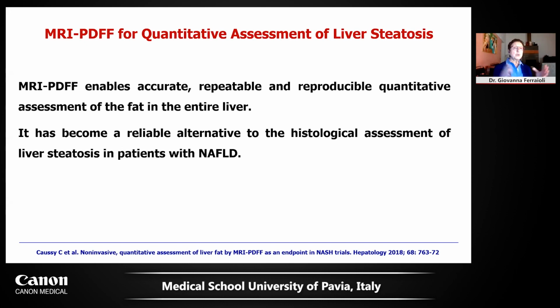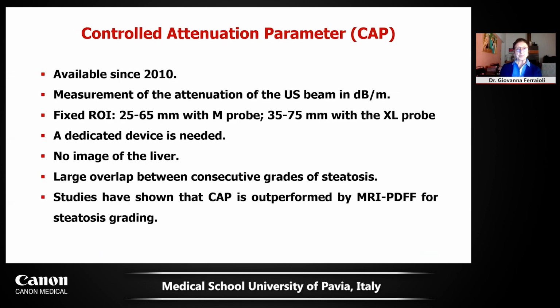On the other hand, we have to take into account that liver biopsy gives an assessment of fat in the liver in a categorical scale, whereas PDFF and tools available on an ultrasound system quantifying the attenuation give a numerical value.